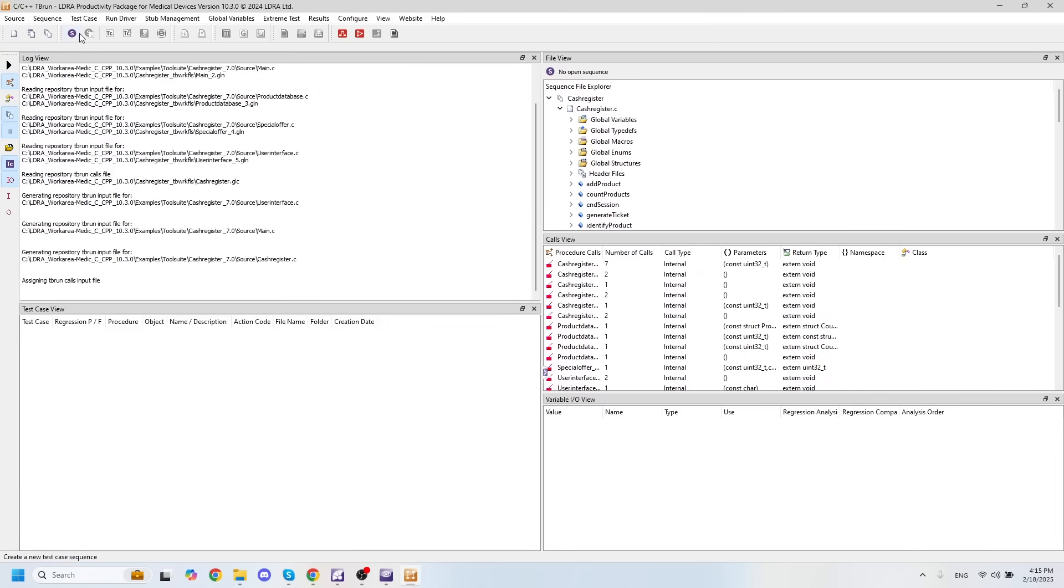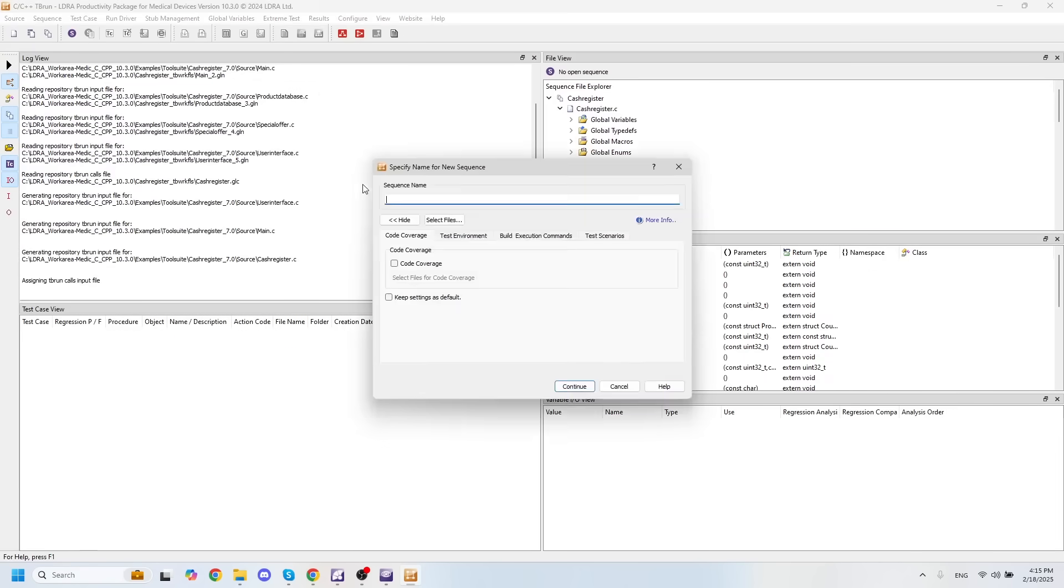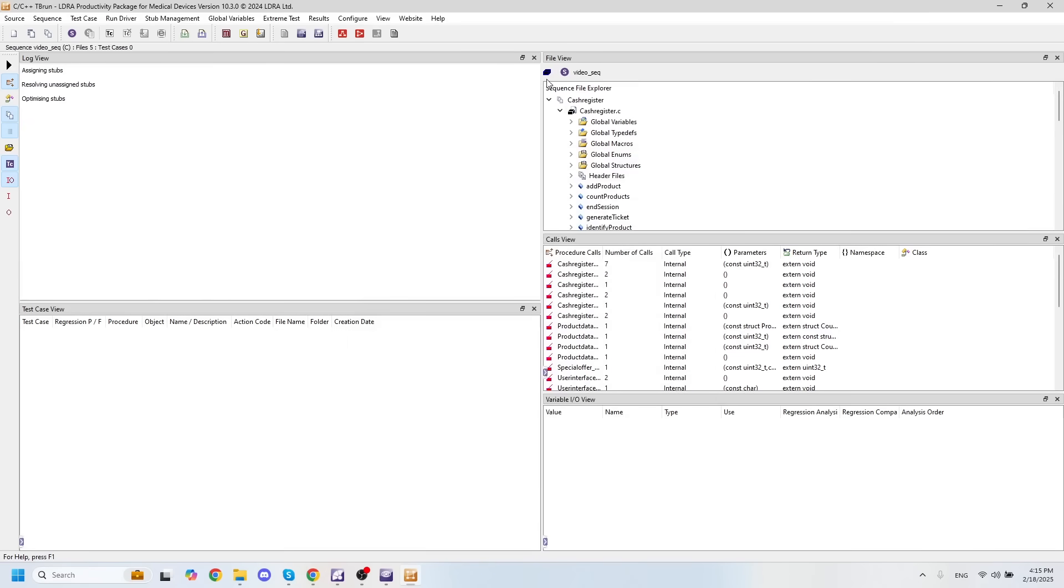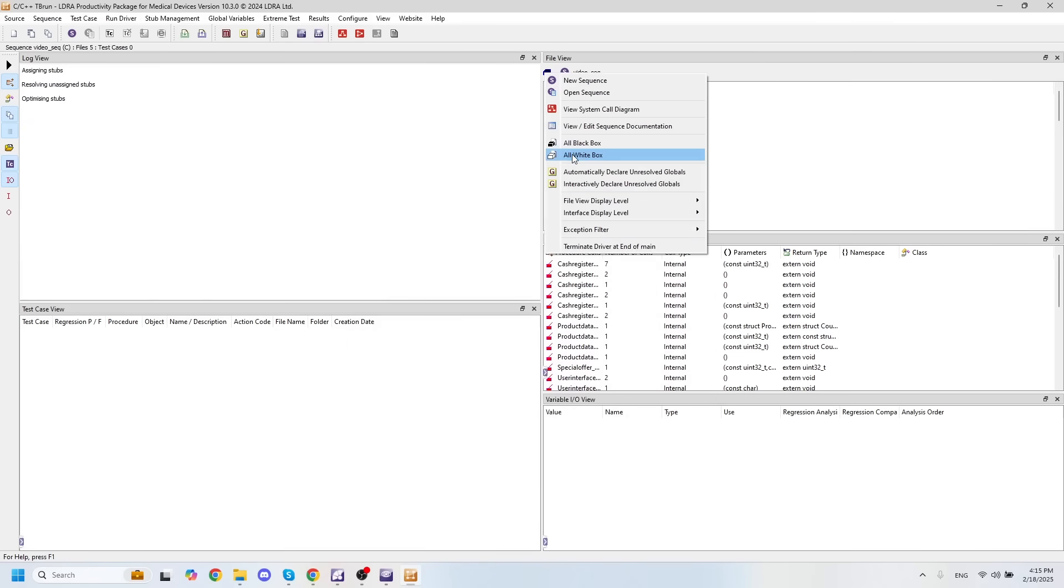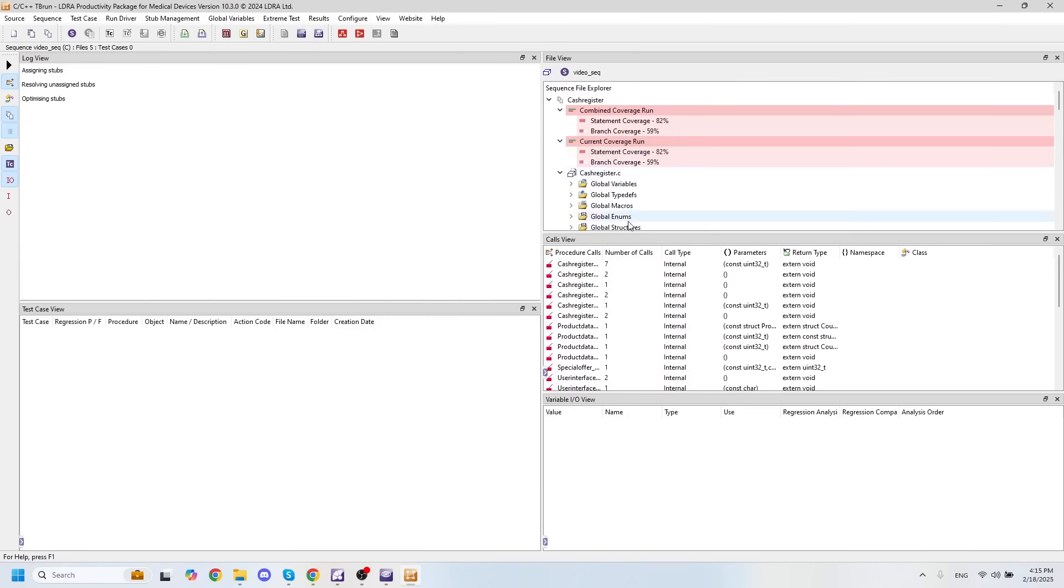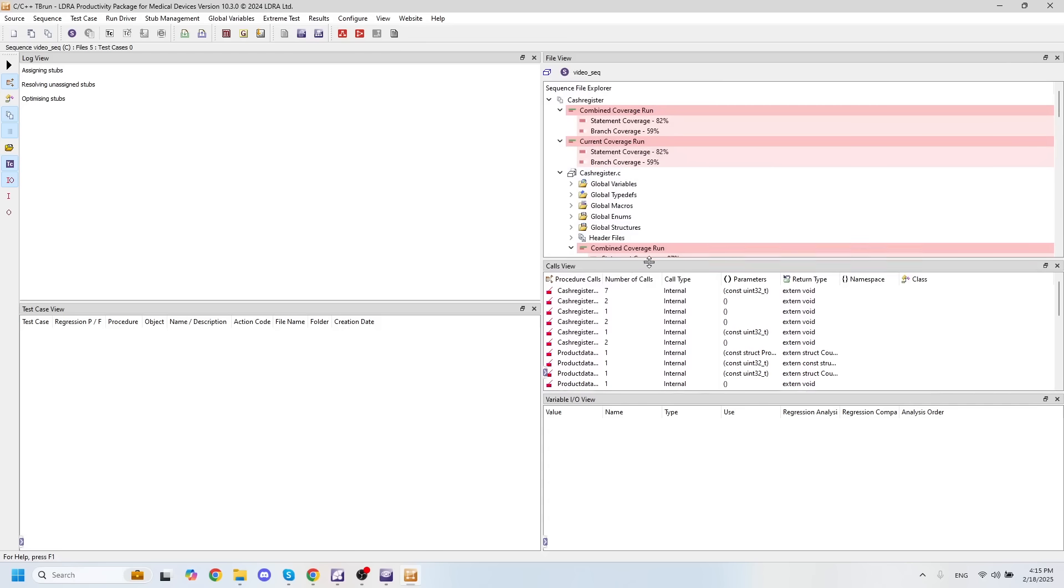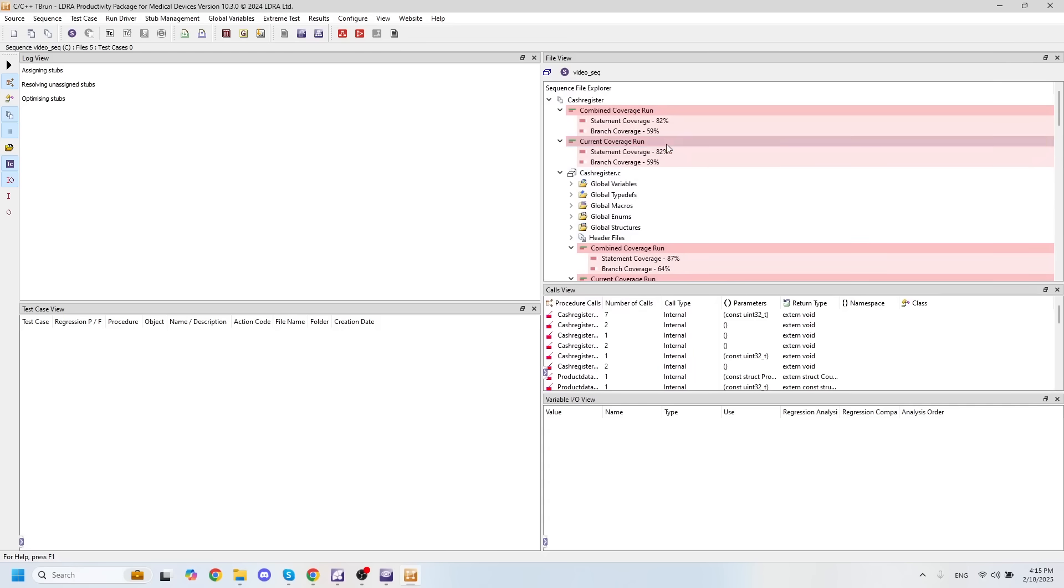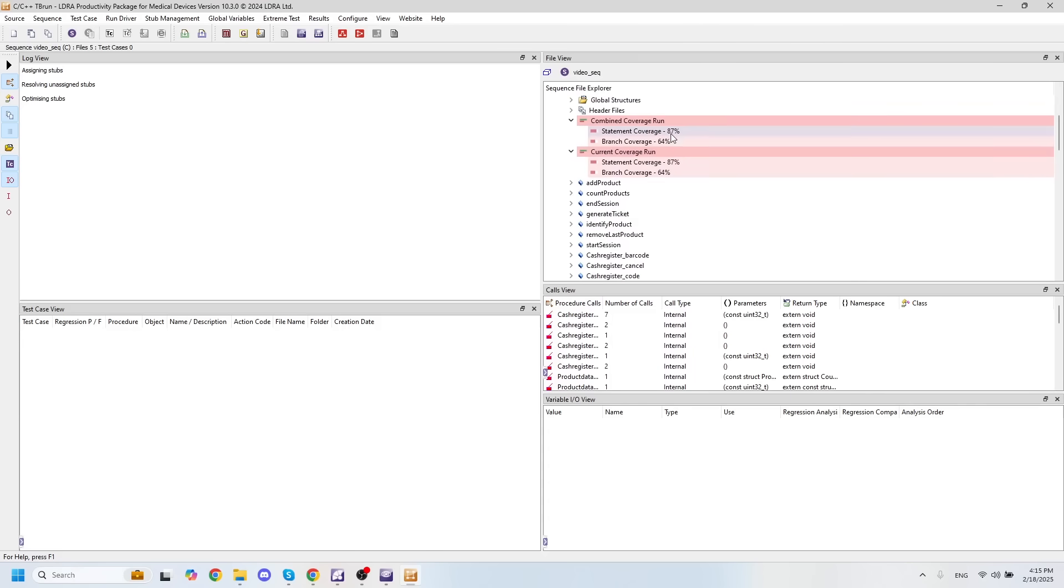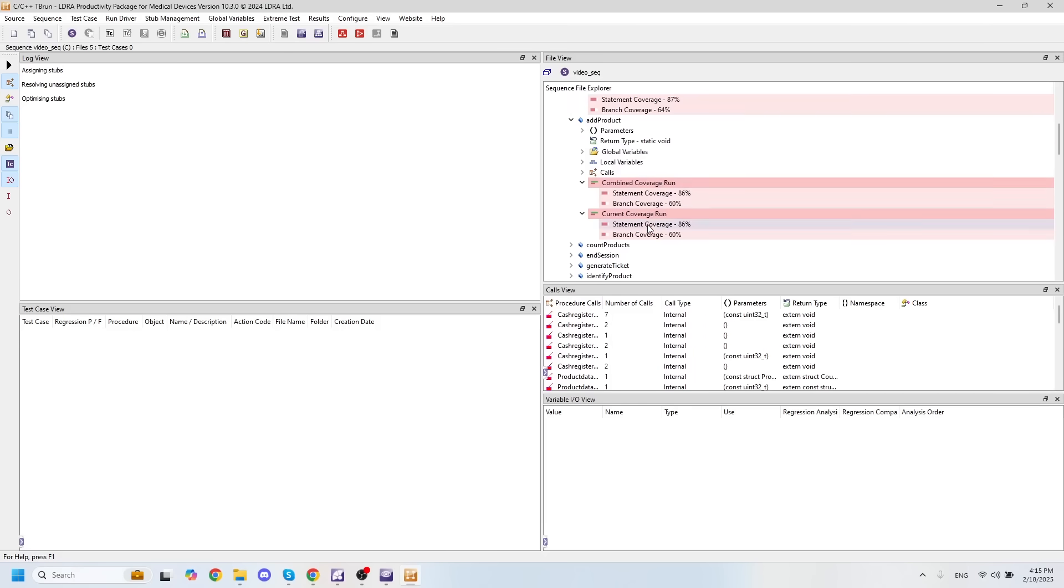And now if I want to see all the code coverage that I've already acquired, I can simply create a sequence. And then we set the procedure to white box mode. And now we can see all of our code coverage with each individual function.